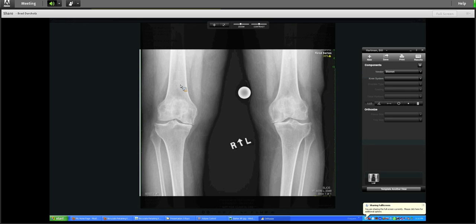So the last thing I just did was click OK, and when I cropped and said OK, that screen grab just pulled into the Orthosize Training software. So now I'm looking at the software, and I have the ability to do some simple zooming features.